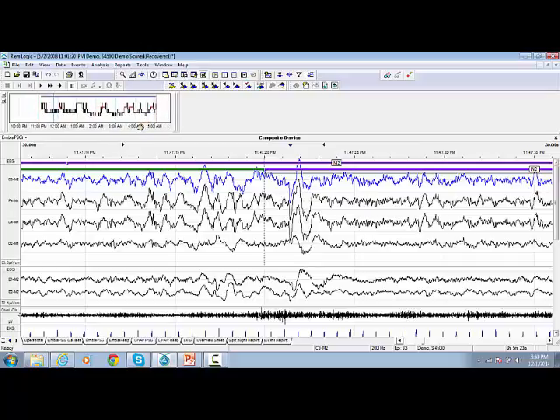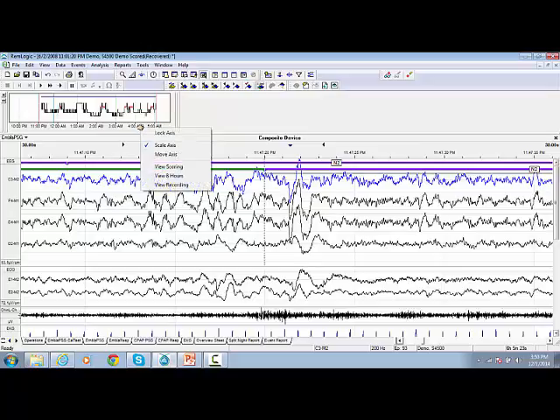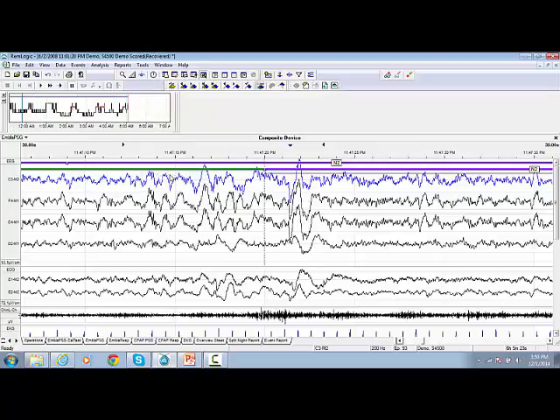If you want to change the time range, right-click on the x-axis and select View 8 Hours.